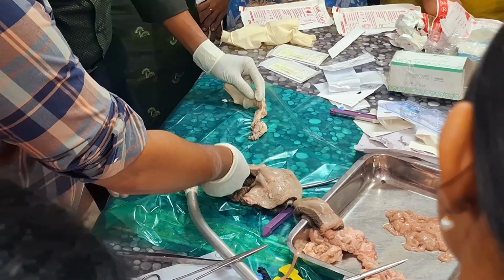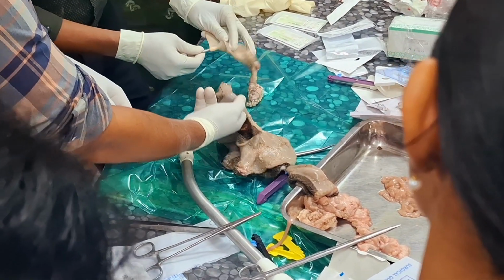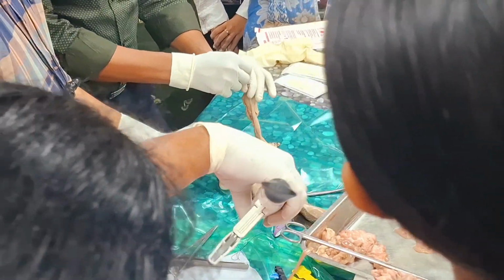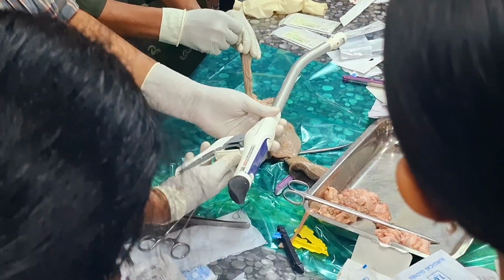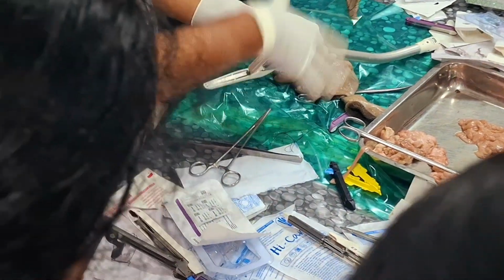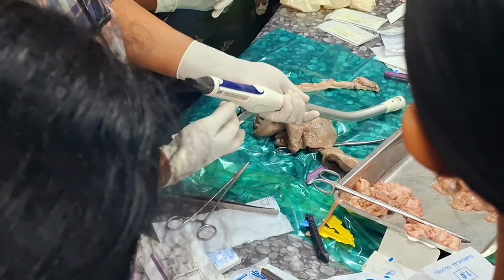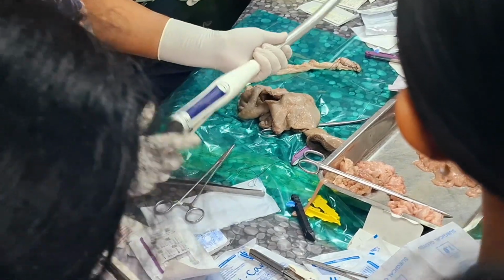Actually, now you have two ends. One end is there, one end is there. What you are now going to do is an end to end. This is called a safety lock. Because if you accidentally fire, it gets fired. So to avoid that, what you do usually is keep the safety knob there until you are ready to fire. The safety knob will always be there.